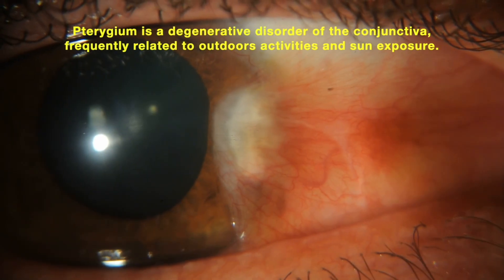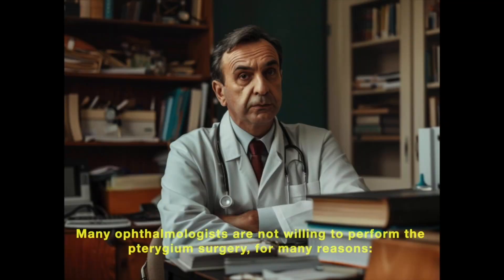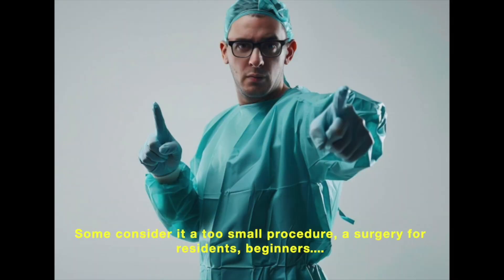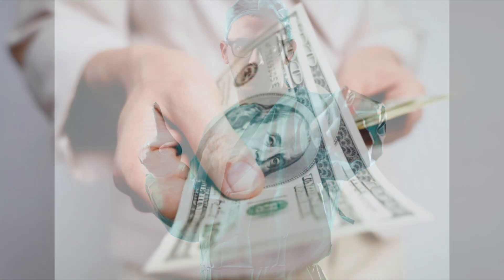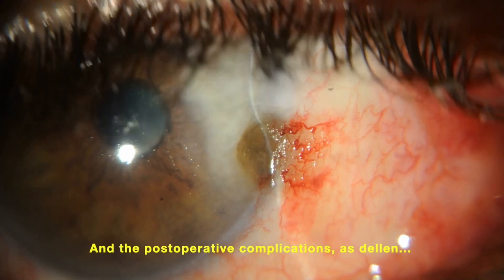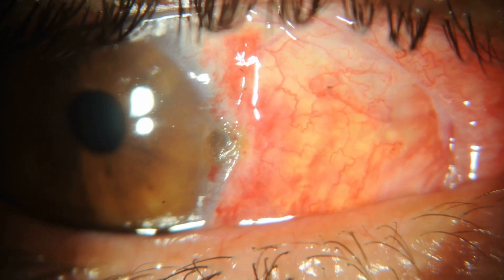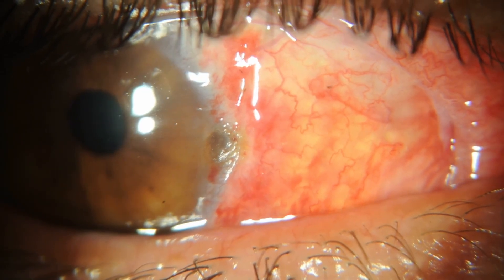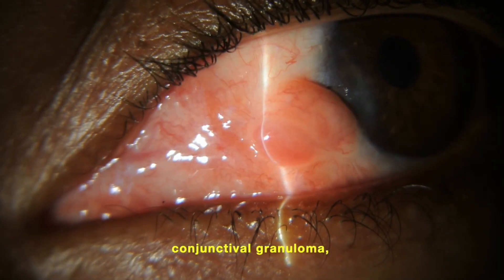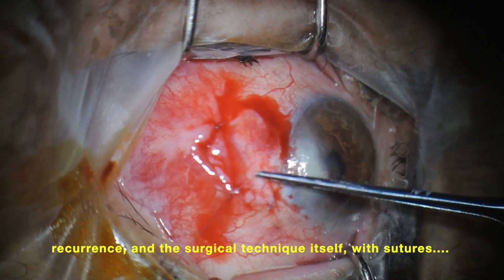Pterygium is a degenerative disorder of the conjunctiva, frequently related to outdoor activities and sun exposure. Many ophthalmologists are not willing to perform pterygium surgery for many reasons. Some consider it too small of a procedure, a surgery for residents and beginners, not to mention the low reimbursement rates, and post-operative complications such as conjunctival granuloma, recurrence, and the surgical technique itself with many sutures.